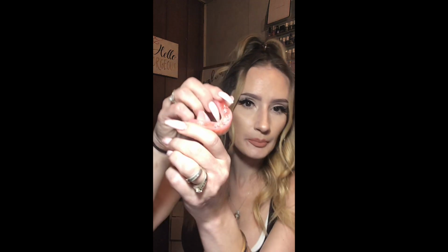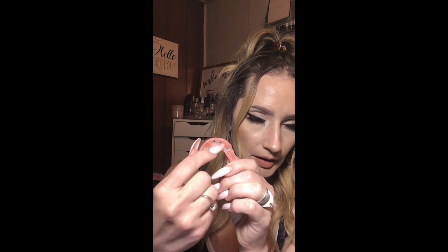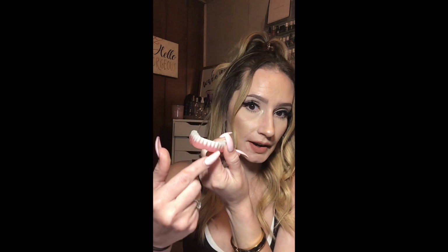Okay, so they don't look as dark out of my mouth. I'm not really sure what is going on. But you see the O-rings in there. That yellow stuff is the material they use to make them fit better. I don't see any metal through this, but maybe you can see a little bit of a shadow. Maybe that does make them look darker. It's hard to say.